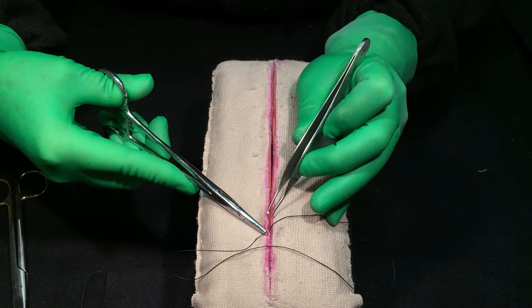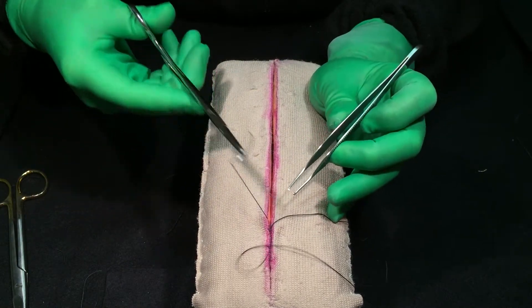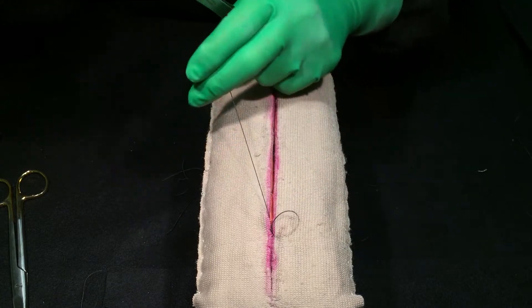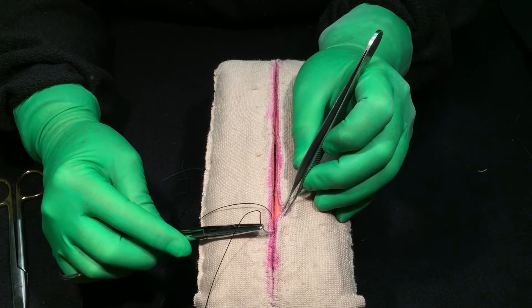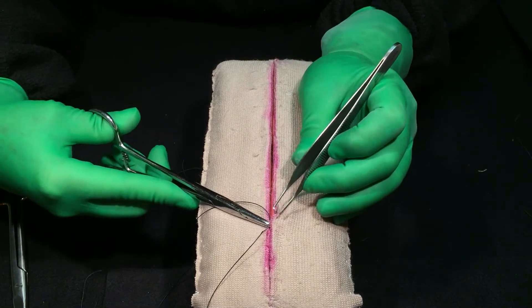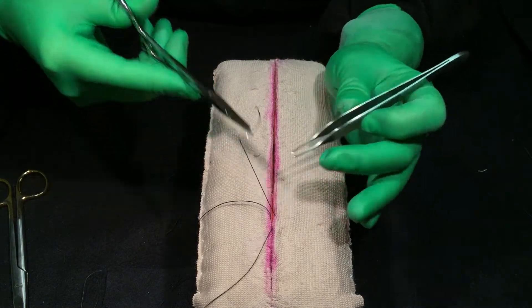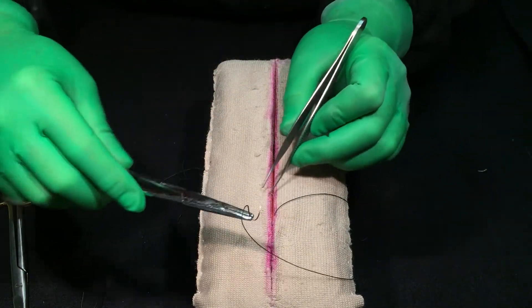Plastic surgeons are going to love this stitch for closing because they don't have to take the stitches out, and it heals nicely. Of course their patients are concerned about cosmesis. So you're going to go on the other side. Now there are two ways to do this: one I call the box stitch, and then there's what I call the Z stitch.